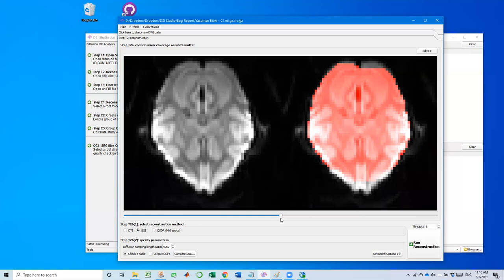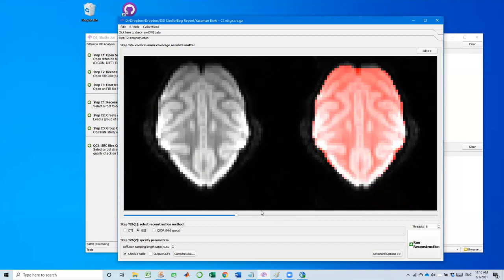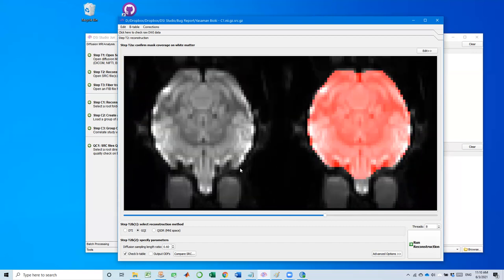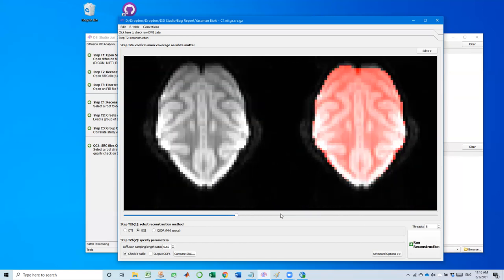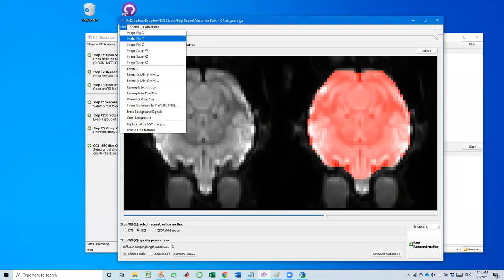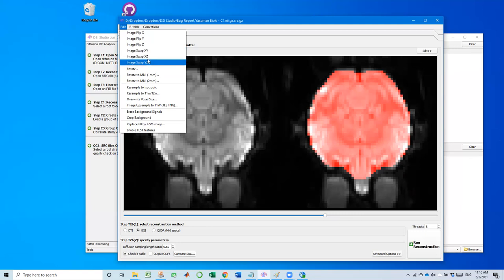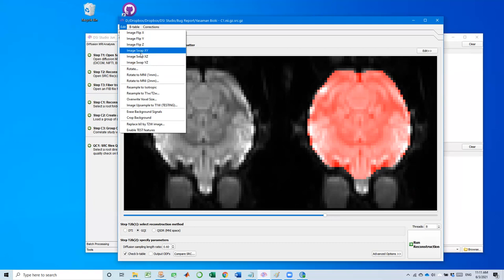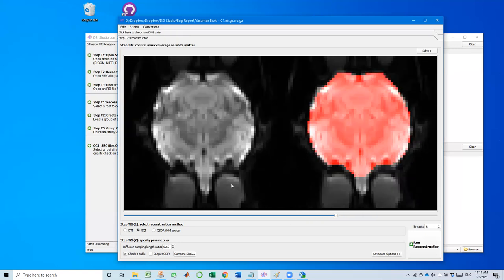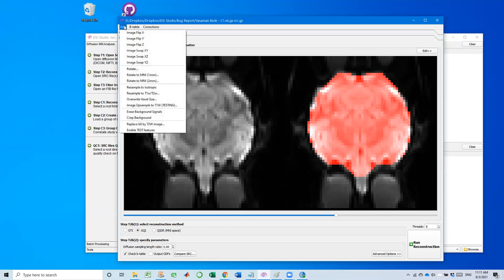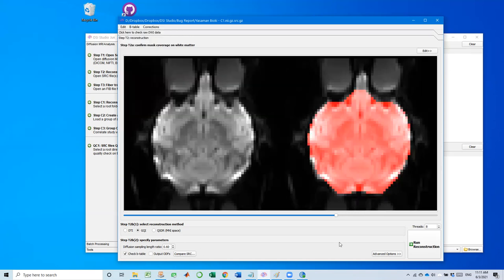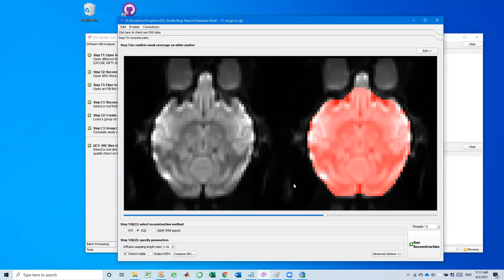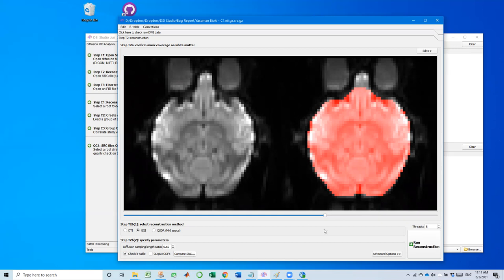So once you click on this, you will see now we get the axial section, but the anterior part of the brain is on the bottom side and we need it to go up. And another thing here is once we flip or swap, it creates a mirror image. So whenever we have a swap, you always need to go with another flip or swap, so that this mirror image will go back to the original image dimension. So here we also need to get the anterior side on the top. So what we do is flip in Y.